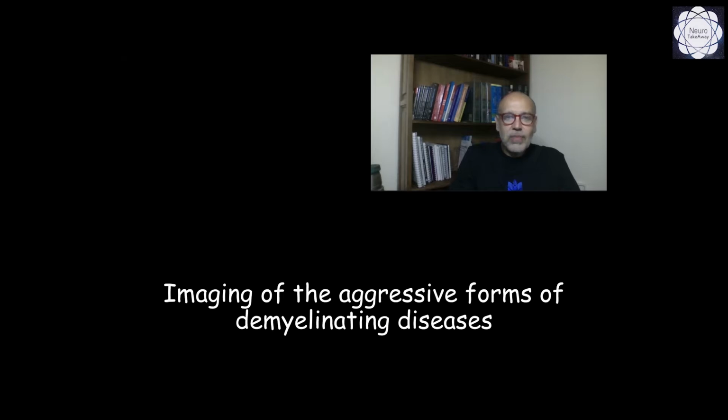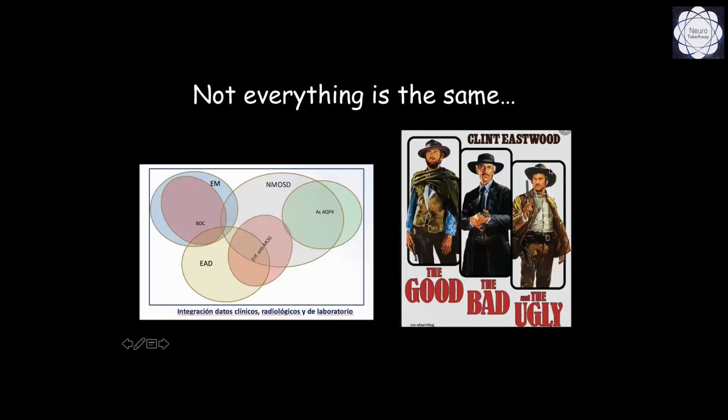Today we're going to talk about the imaging of the aggressive forms of demyelinating diseases. As you know, every disease can have different levels of aggressiveness, and demyelinating disorders do not skip this rule. It can be mild, moderate, or severe. Here you have a classification of the most important and frequent demyelinating processes based on immunology.